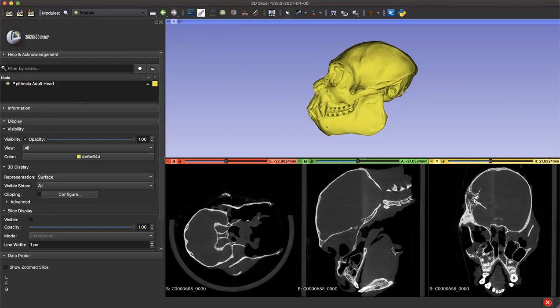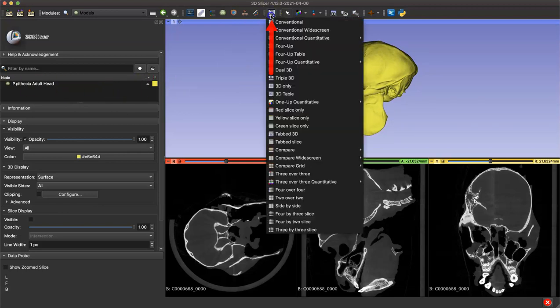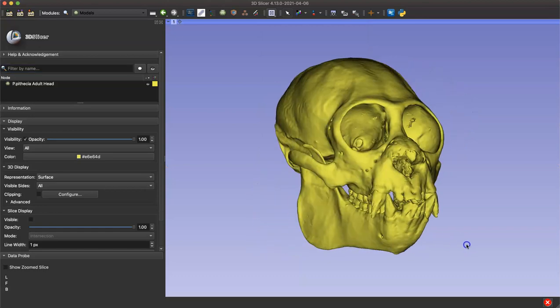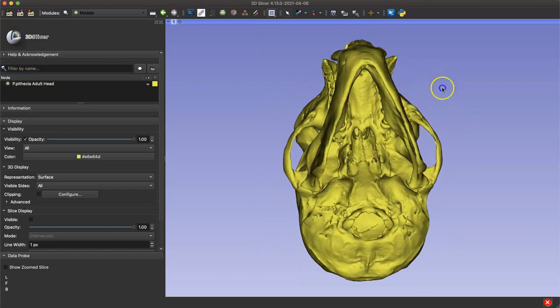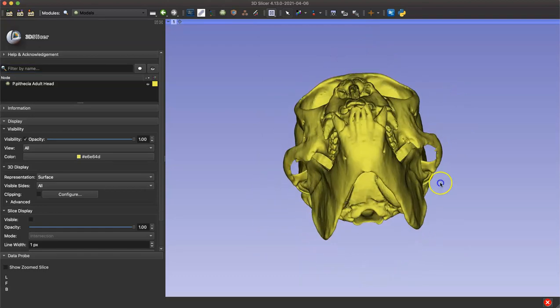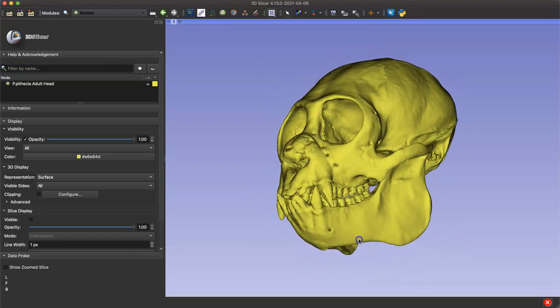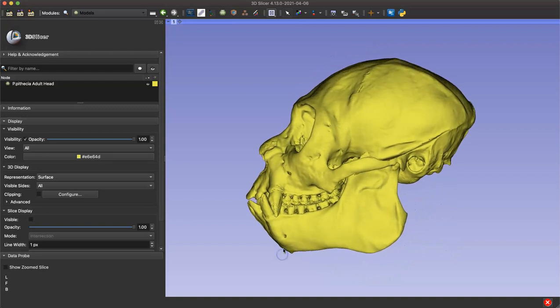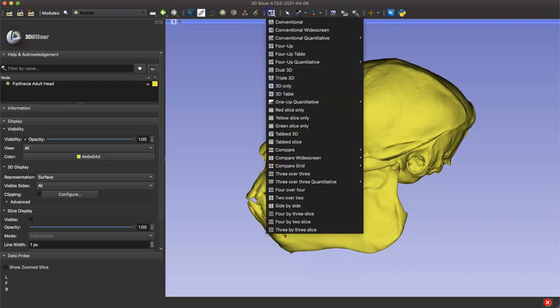You can change the view of your workstation by clicking this button at the top of your screen, which gives you a series of options on how to organize your windows. For landmarking, it might be helpful to use this 3D only option, but there are benefits to being able to see the slices of your volume while you landmark. I usually just use conventional mode.